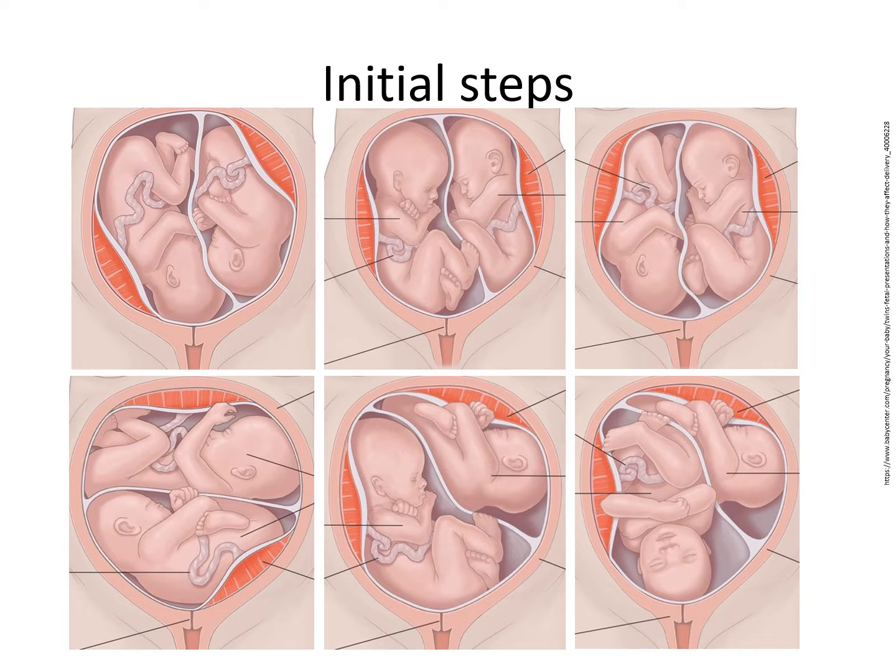So in starting one of these scans, the first thing that should be done is an orientation sweep to evaluate the position of each fetus. As you can see, there are many different position types and several methods to establish this.